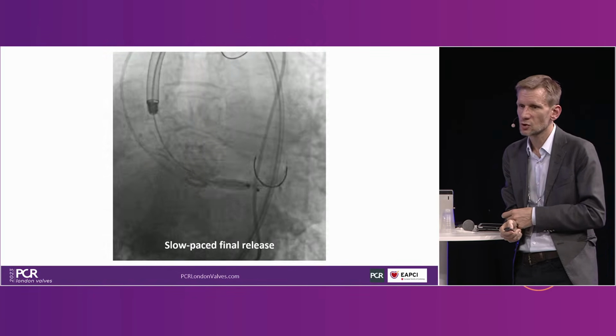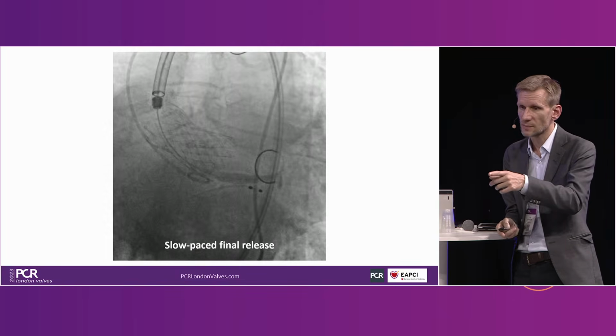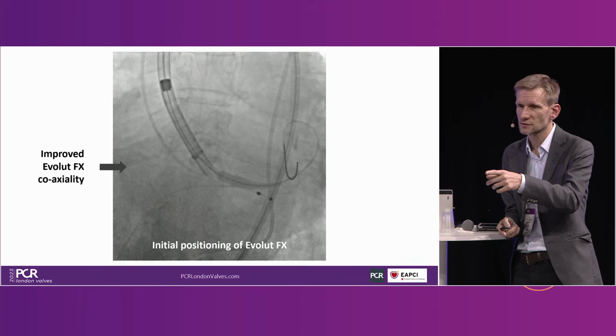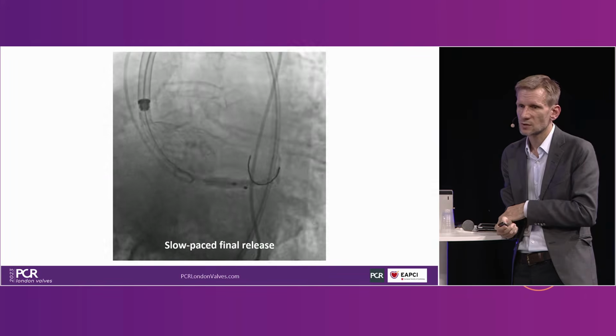And then here, slow paced release. I think this is not a strict cusp overlap. We can go back to be sure. Look, in the beginning I started for sure. No, seems cusp overlap. Yeah. Okay. So then we go for a slow release.